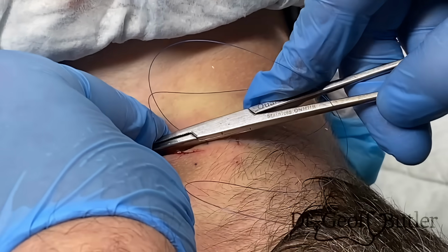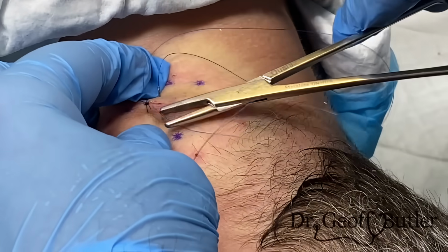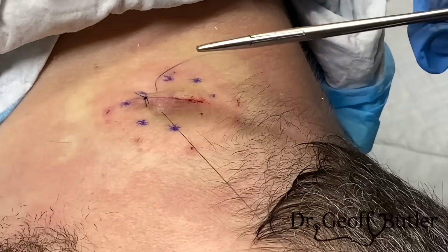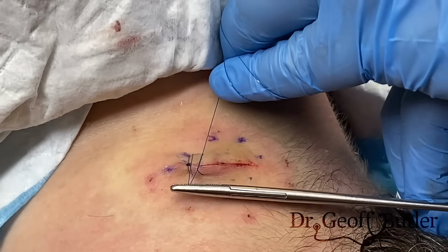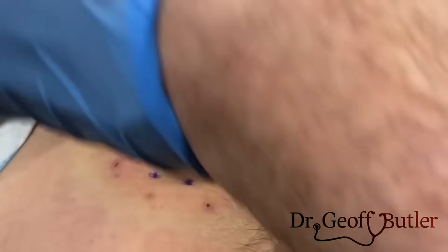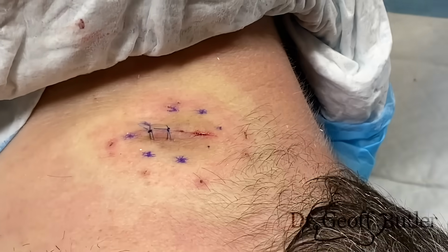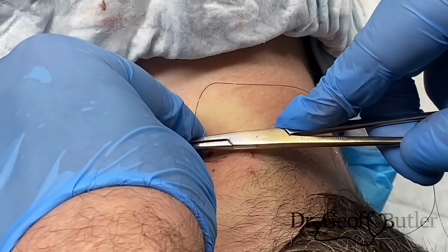And it'll also be harder to drive these in because of the elasticity of the tissues. So again, it'll seem like the needle on the end of this thread's a bit dull, but obviously it's not. So here's our 3 loops here. So again, normally where I'd pull this way over to the side, I can't. So just work with smaller spaces right on top of it. We want to make sure that's still a good stitch. So you have to be careful. If you can't pull down on it, your stitches will all be loose and they won't be effective. So there's always that balance between making sure you've got good apposition and not tightening it too much.